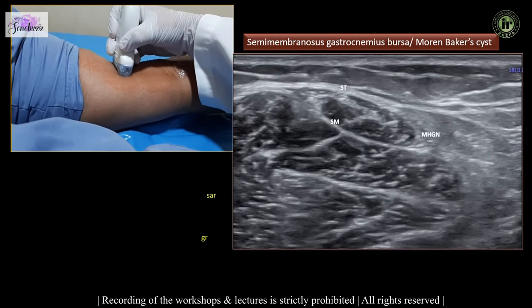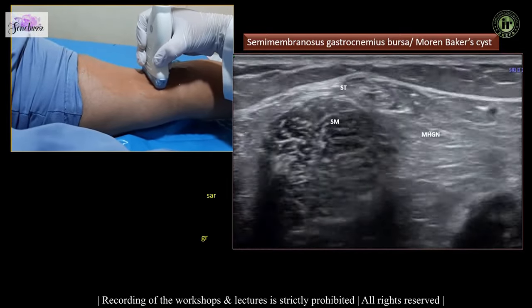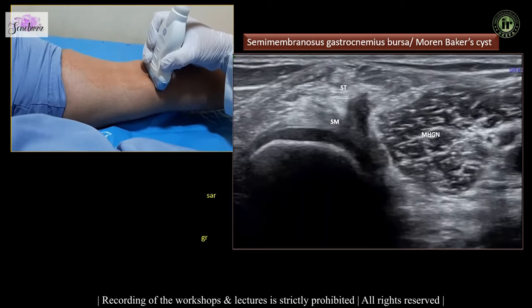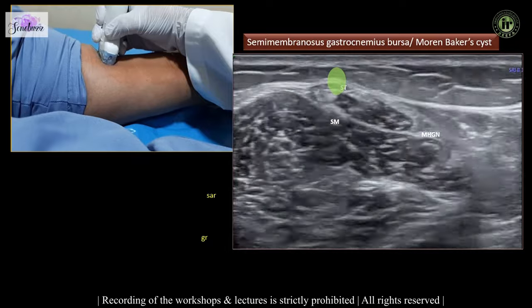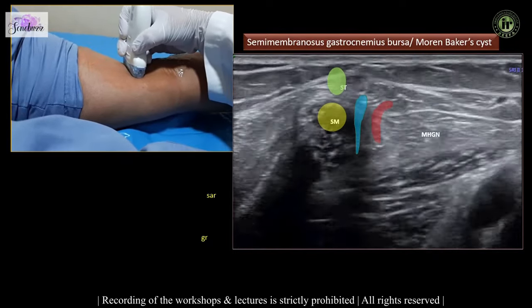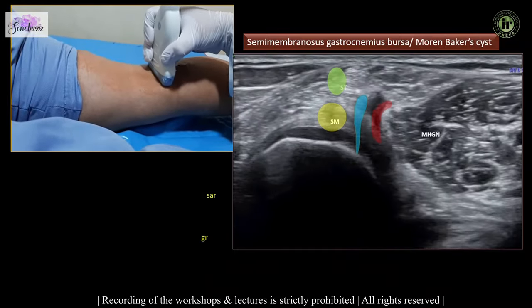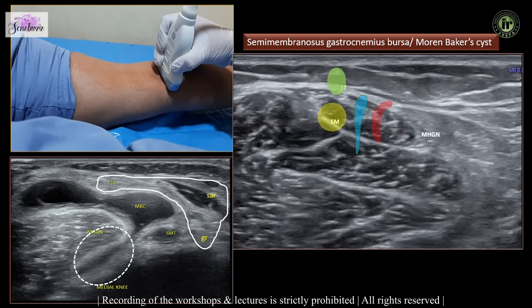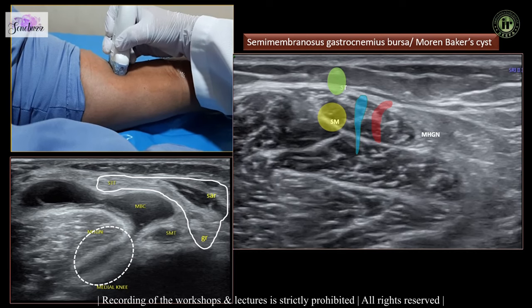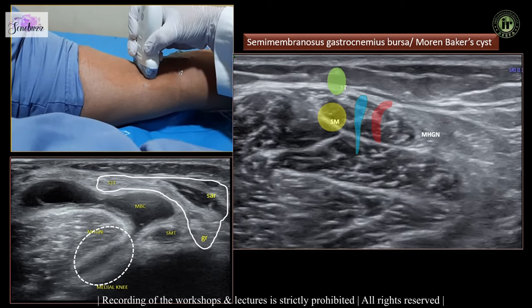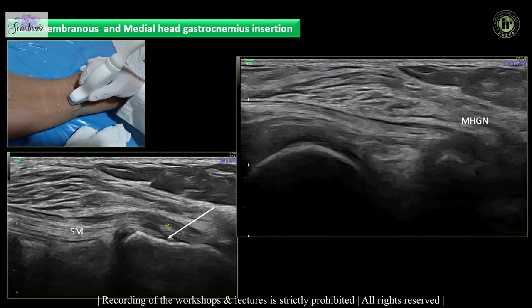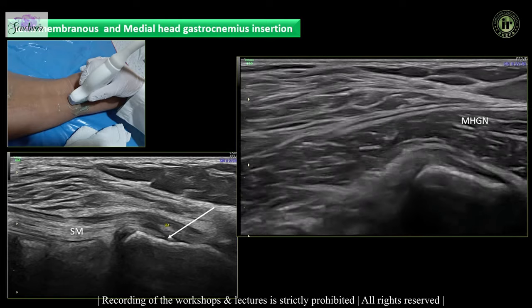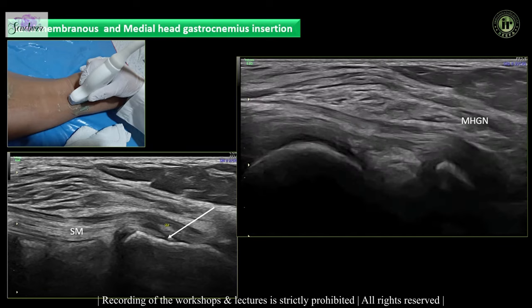Scanning down on the medial aspect of the thigh, you can see the muscle fibers of the semitendinosus and semimembranosus progressing towards their myotendinous junction and forming their respective tendons. On the lateral aspect we can see the medial head of gastrocnemius arising with its typical eccentric tendon location. Between the semimembranosus and gastrocnemius tendons we have the semimembranosus-gastrocnemius bursa — the Baker's cyst — and it is important to show the pedicle joining into the cavity. The semimembranosus passes distally to insert into a fossa on the posterior tibial epiphysis, with the medial head of gastrocnemius crossing it to get its proximal insertion into the medial condyle of the femur.